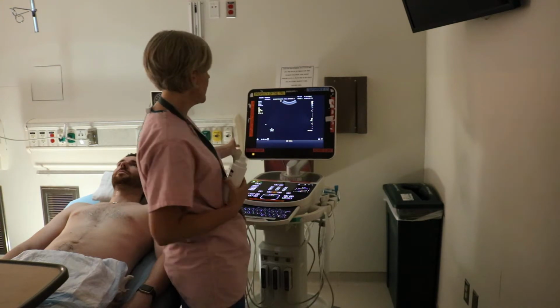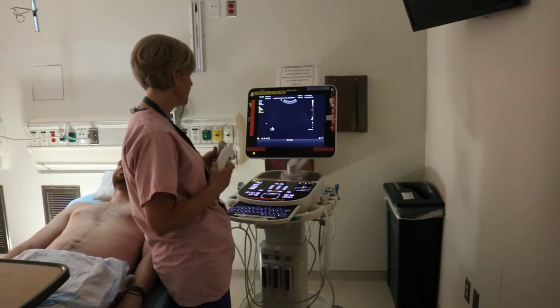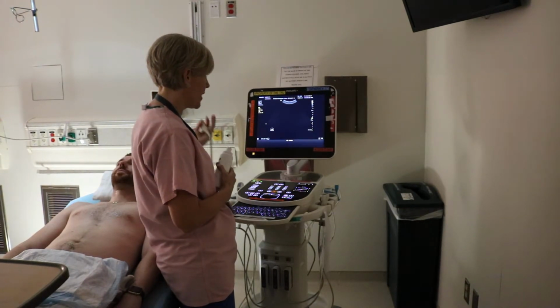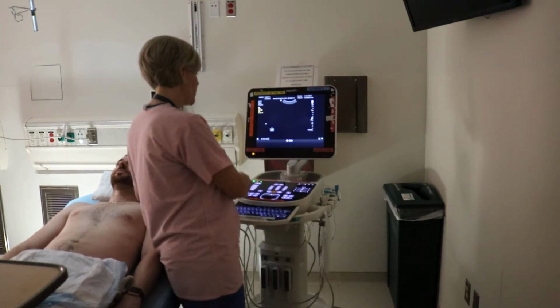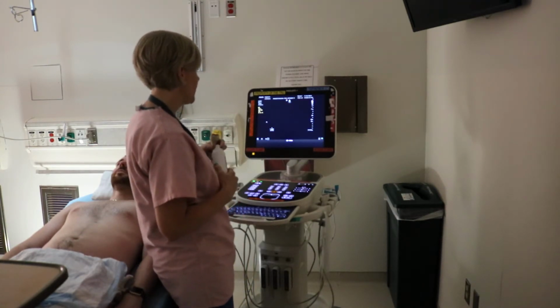Now we're live. You can tell from the screen that we've got the curvilinear transducer. I prefer to use the phased array, so for this exam we'll show you it with the phased array. We just switch the transducer to the one in your hands. And now we've got the phased array transducer.